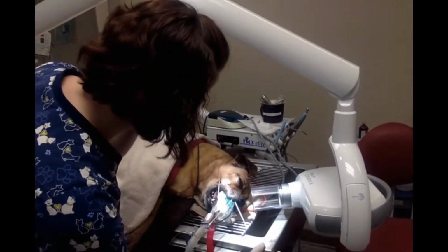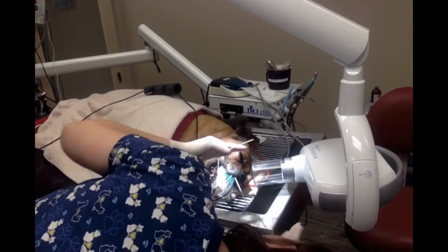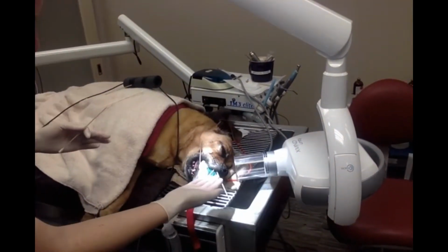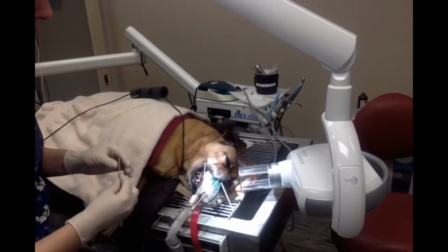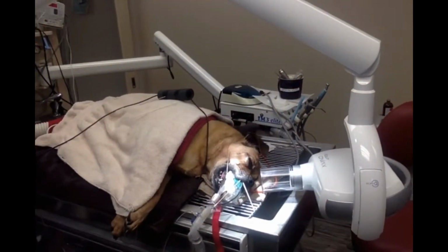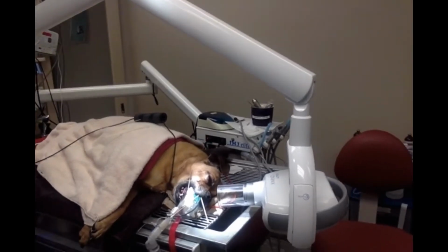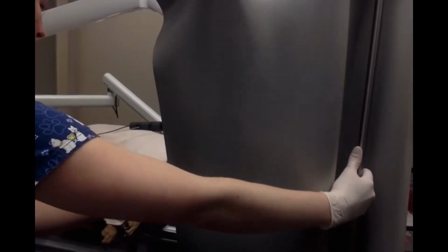And then I'm going to come down from a rostral perspective and take a look. And my sensor is nice and parallel in between the nares. And I have a nice view, so hopefully this will be a great shot. And then we always want to make sure we use our personal protective equipment. So I'm going to pull up a lead shield that we have had fashioned here in our hospital. I'm going to put it in front of the patient, and then we're going to take our image real quickly.